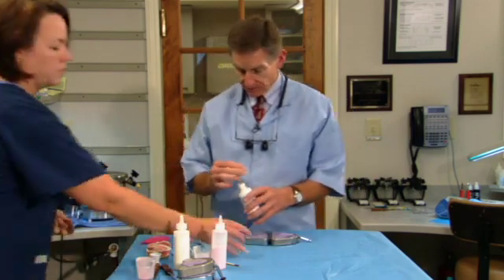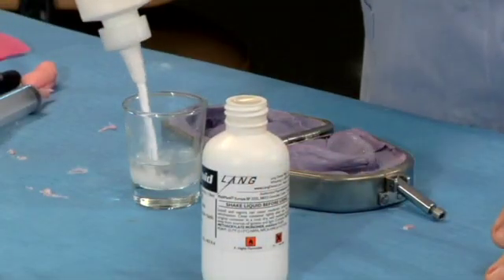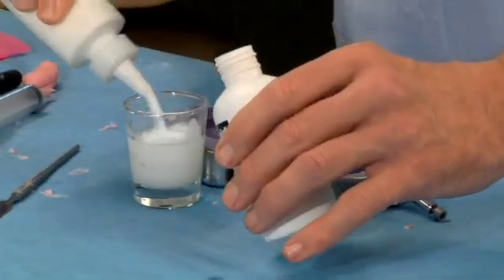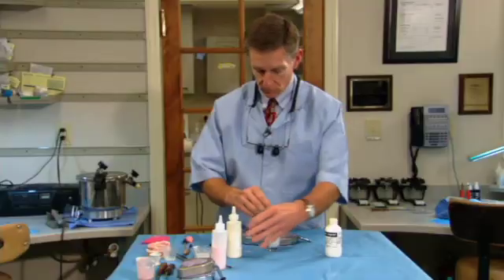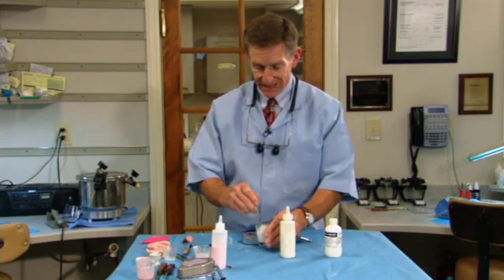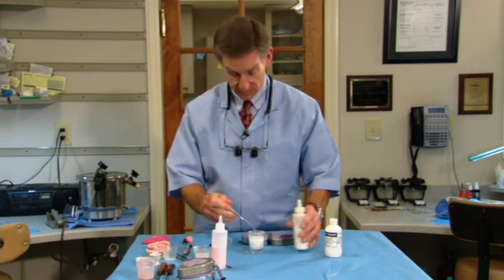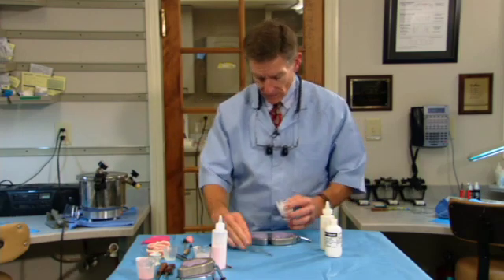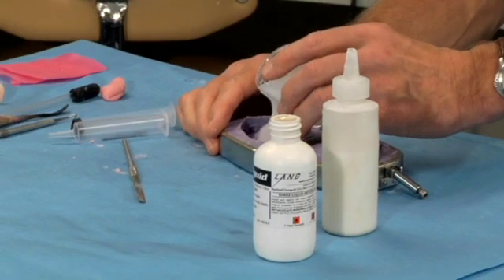I'm just going to mix some clear acrylic. This is splint acrylic or ortho clear. We're going to mix it to a pour consistency. That's P-O-U-R, not P-O-O-R. I'll tell you what I'm going to do is I'm probably not even going to use a monojet syringe for this. I'm just going to let it leak right into the teeth.